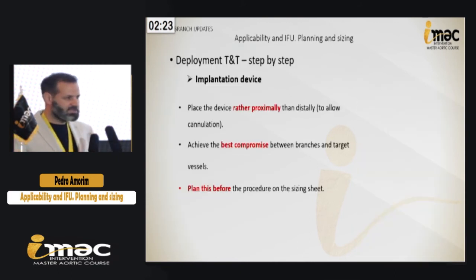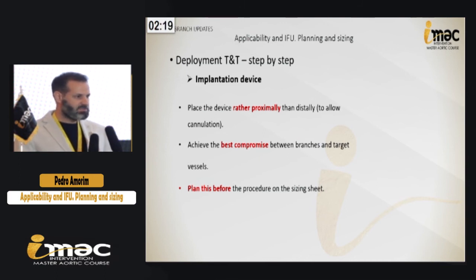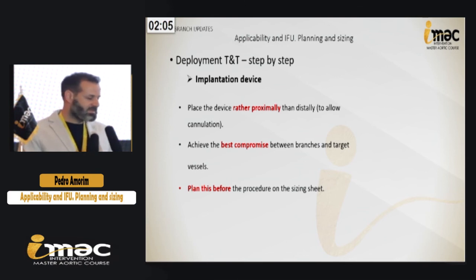And sometimes we need to have some compromise, as Professor said before. Sometimes we need to readjust while we are opening. By knowing the target vessel that it comes at that clock position, we can, while deploying the device, rotate, anti-rotate, and try to fit better to the anatomy of the patient. If necessary, if more confidence, we can go a little bit proximal.